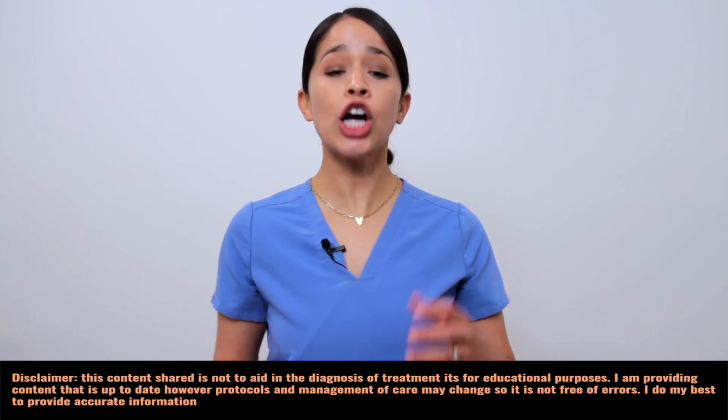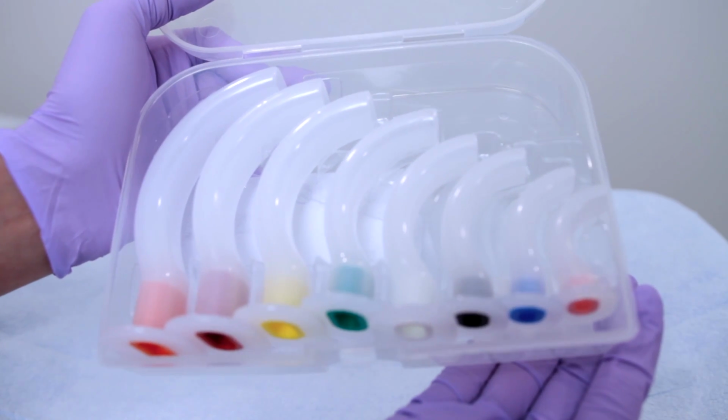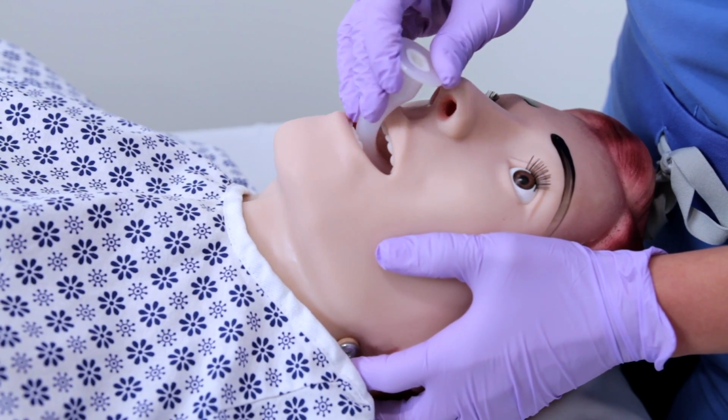If your patient is unconscious, having the knowledge to manage your patient's airway is essential in a critical care setting, ER setting, and/or post-anesthesia care unit. We use oropharyngeal airways, referred to as OPAs, and there are different sizes of OPAs. So in today's video, I'm going to show you how to size and advance your patient's OPA.